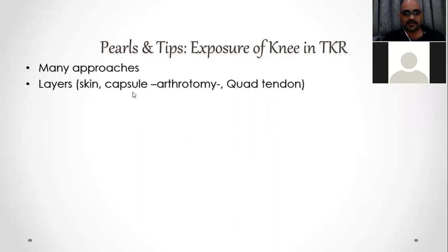which are the skin, the capsule, which is the arthrotomy, and then the quadriceps tendon. And the quadriceps tendon incision is the name we will see, whether it is medial parapatellar or other names that vary the exposure in the total knee.